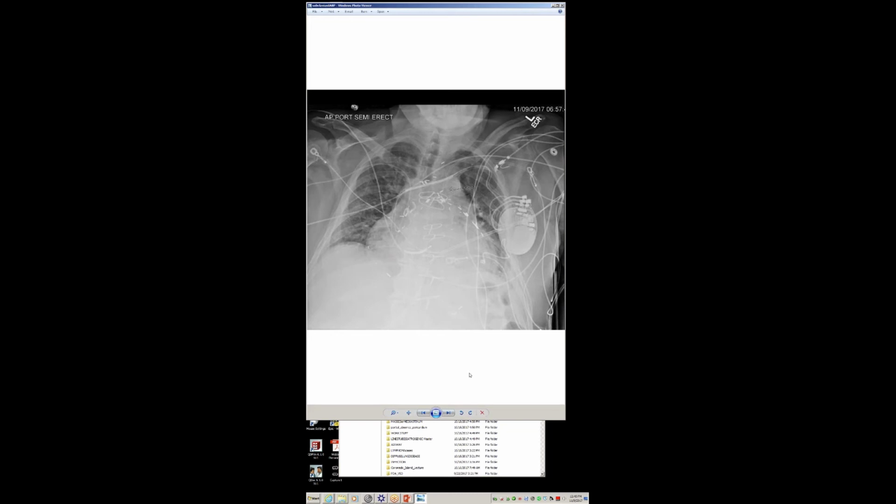And they don't want to push in catheters because they take infection in with them. So it's easier to pull a catheter out. That's safe, but it's a septic problem if you try to push a catheter in. So they've never been able to adjust it. And the marker is sitting just at the top edge of the aortic arch, and previously, before a couple of days ago, was actually floating about a centimeter above. And we could see the bottom marker in that case in the upper abdomen. So I looked, I couldn't see either marker, but they're like, oh, it's there, don't worry. I'm like, okay. Okay, I'll load up my case for next week. I'll pull it up. Yeah.